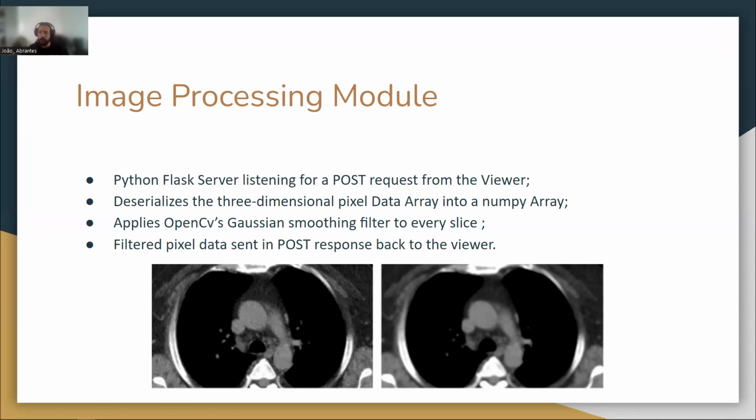This model represents a proof of concept of a remote service for image processing, which demonstrates the feasibility of our proposal of having external services not dependent on the core of the viewer, which can operate by themselves and communicate with a central image viewer.